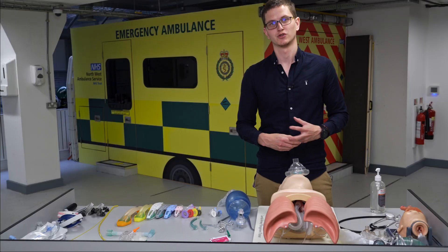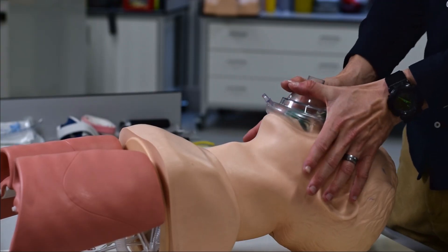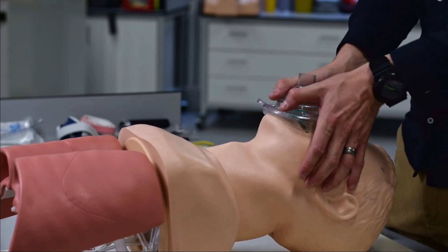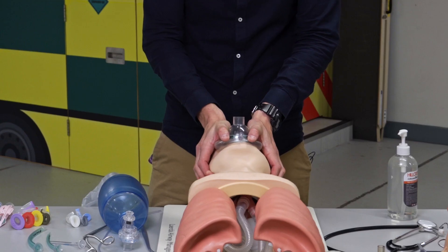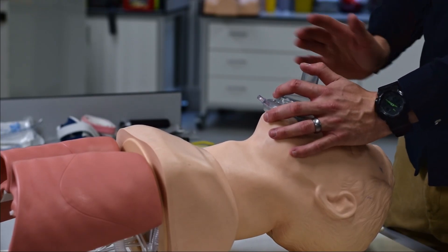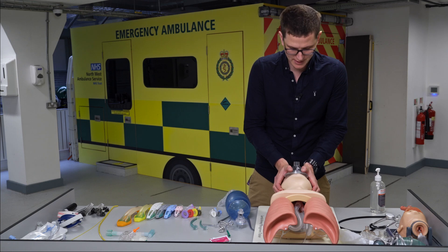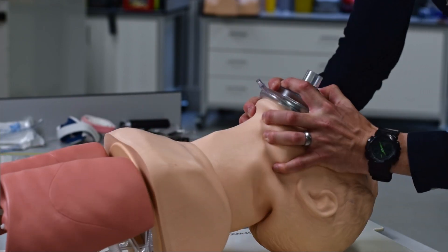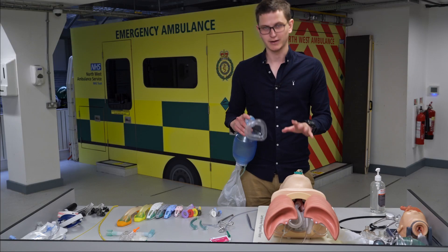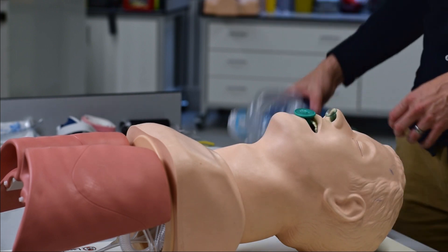If the C-E grip isn't working, try the two-thumb technique — also called the thenar eminence technique. Put both thumbs on top of the mask and grab the mandible with your index fingers, which are your strongest fingers, rather than three weaker fingers. This works well for smaller hands. You're bringing the face and mandible into the mask. This technique also allows you to perform a jaw thrust and ventilate simultaneously — lift the mandible up with your fingers while the thumbs hold the mask. Good practice is to use a BVM with two people, even in cardiac arrest.